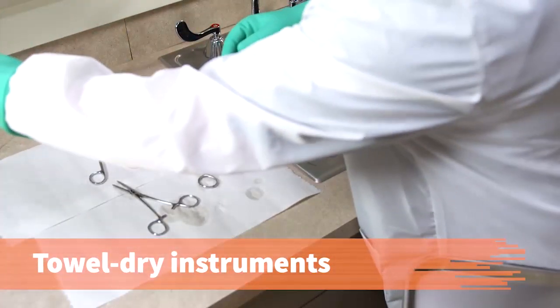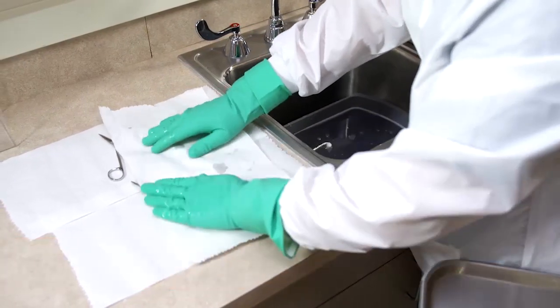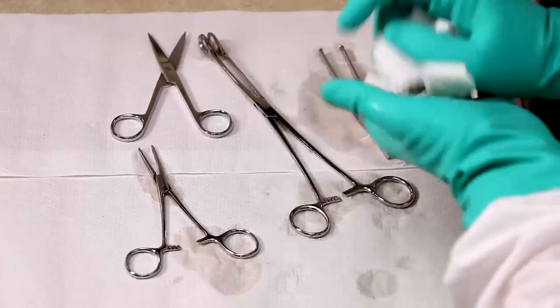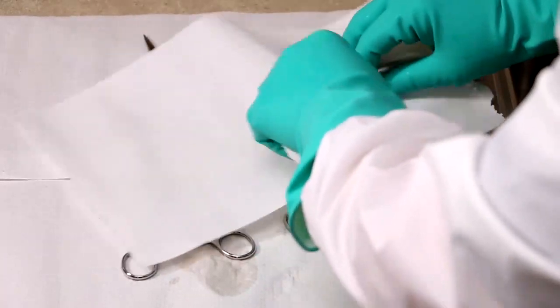Towel dry all instruments. Do not touch the paper towel dispenser as you are obtaining towels, as touching the dispenser with soiled utility gloves will contaminate it. Dry thoroughly, as wet instruments can rust or become dull, and water on instruments can dilute disinfectant or sterilization chemicals.